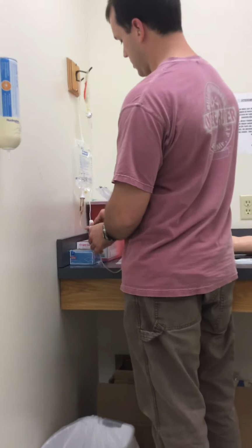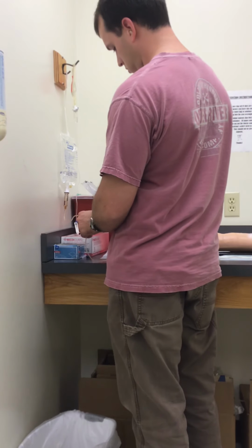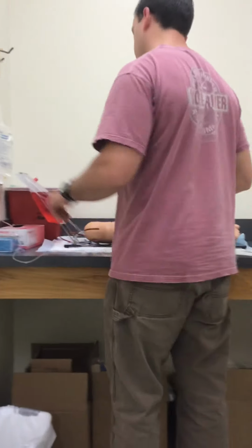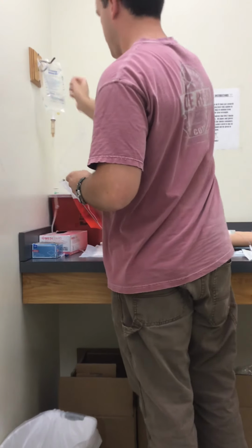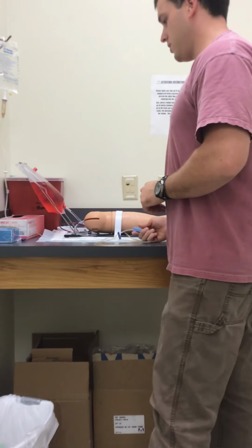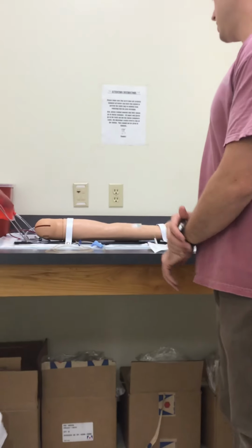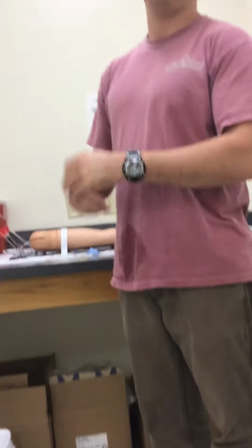I can clamp my secondary and throw it away. Raise my primary. Set the rate back to what it was originally, or per physician's orders. Once again, ask my patient if there's anything he needs. Wash my hands and leave the room. And document.